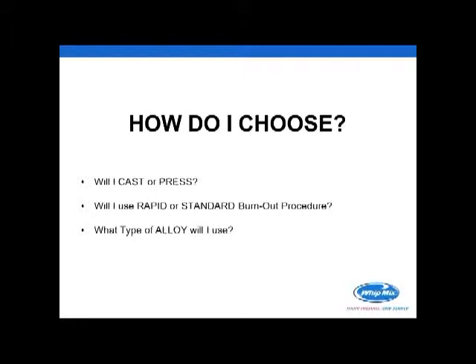Now, most of us are turning towards what are referred to as universal investments, those that can be used for everything at this point in time. And if you're using a truly universal investment, you'll be able to use it for any of these procedures that you see.